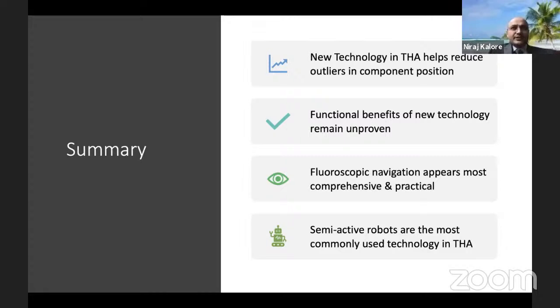The hip is definitely more important in some ways. The hip has this thing where if you go out of a certain limit, then it suddenly becomes so bad it's just going to dislocate. But the premise is that the surgeon should be able to identify that. When I do a simple manual hip replacement, I put it through so much testing and I change so much.